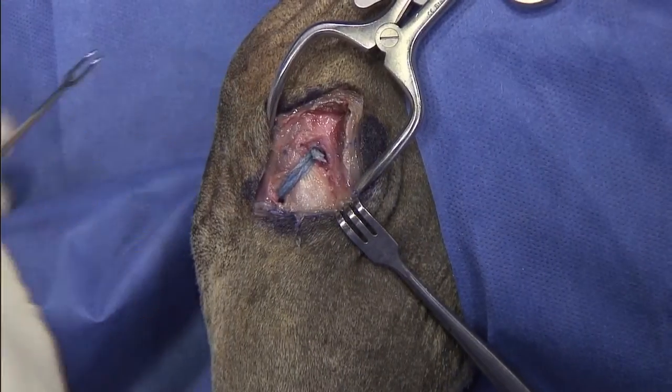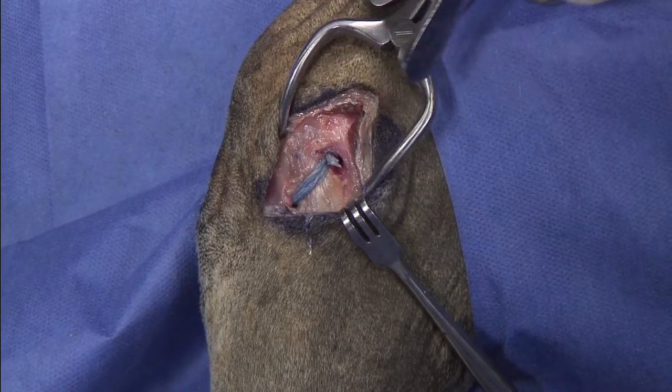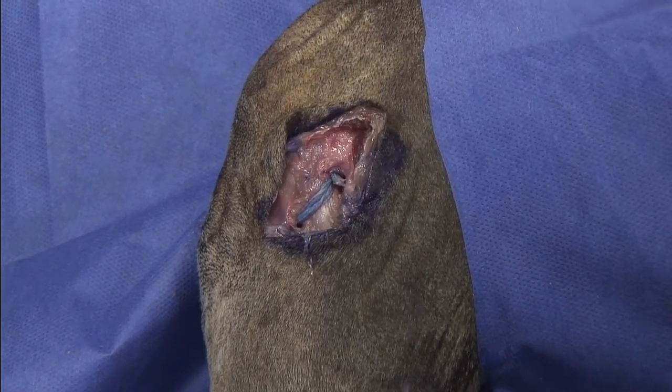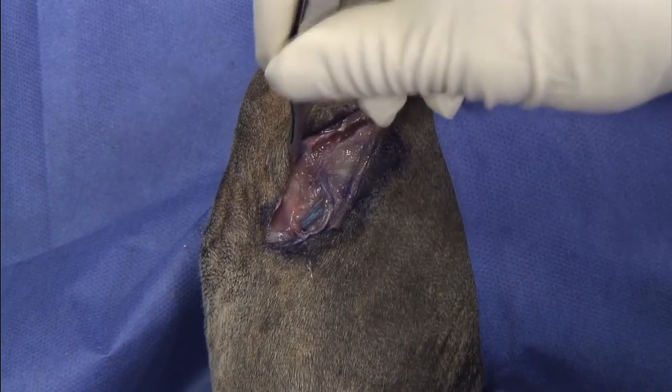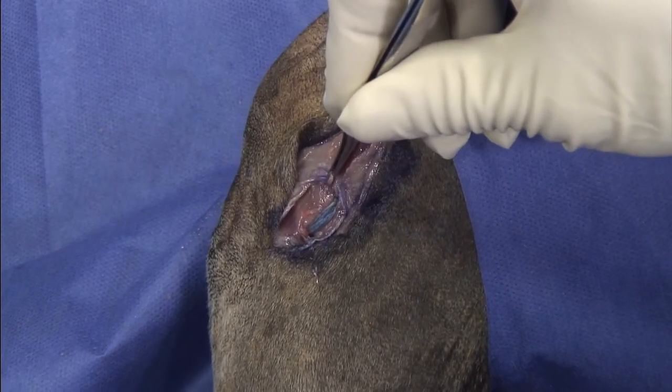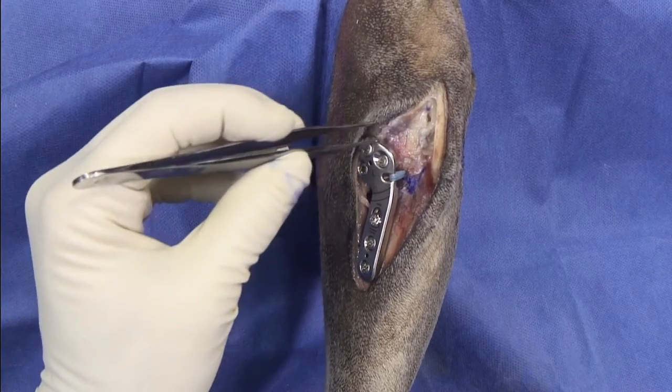Regarding closure, I would go ahead and close the fascia here, and would generally try to imbricate the fascia to this edge, then progress to the closure on this side. We have completed our tibial internal brace, and as you can see we have the suture in place.